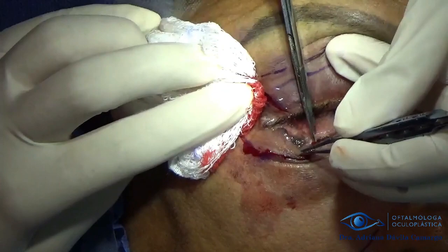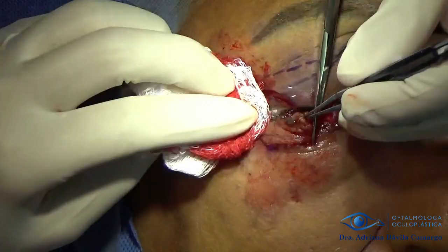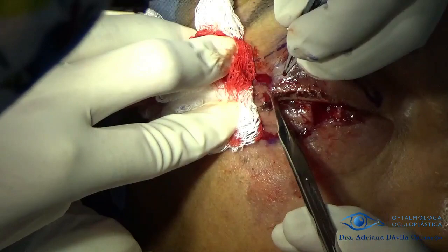We begin with the incision using a scalpel within the limits we previously marked, and later with Steven scissors we remove the tumor and its margins. This is a tumor that is extremely attached to the deep plane and bone, so it is a bit complicated to remove it completely.